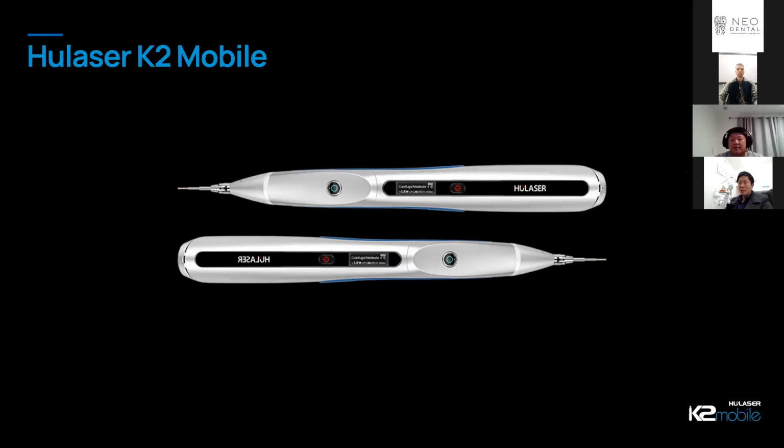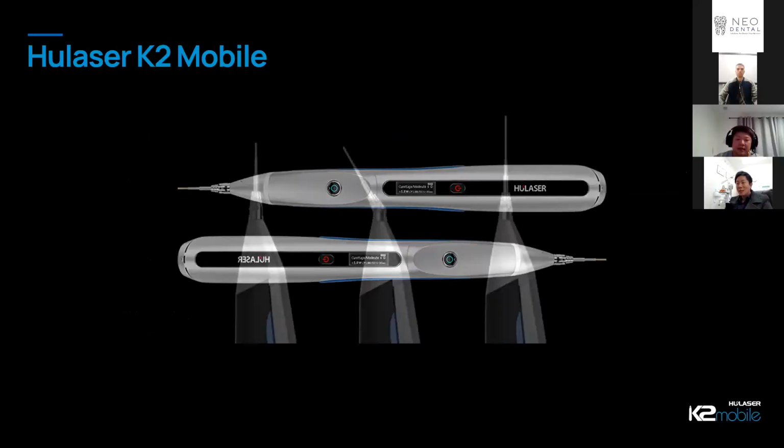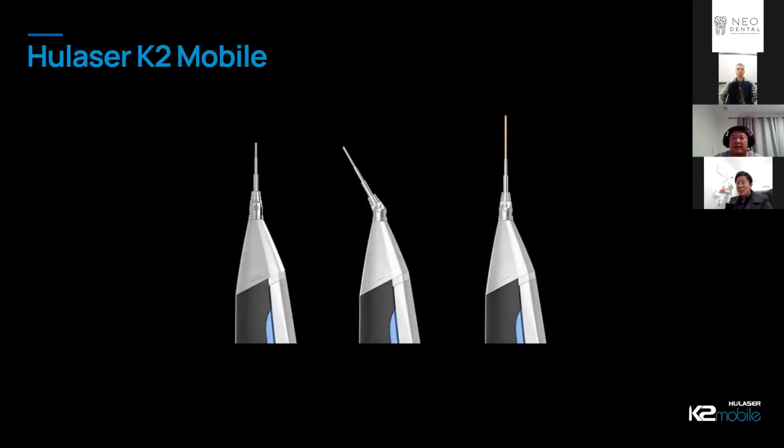And so this is what I was saying before. Sorry, the picture's a little bit pixelated, but you can see here that no matter which way you orient the device, you can clearly see the settings and the writing the correct way. And you can see the versatility of the laser with changing the angulation, and that actually goes to 90 degrees. And you can extend the length of that fiber however long you need it to be.